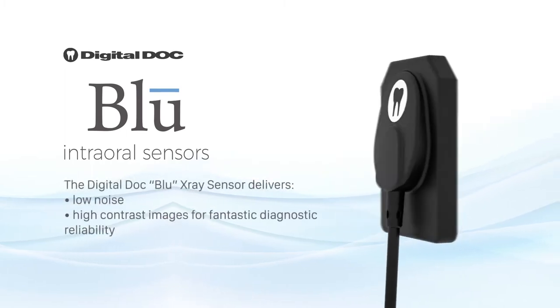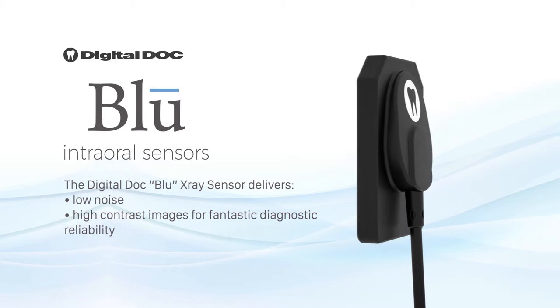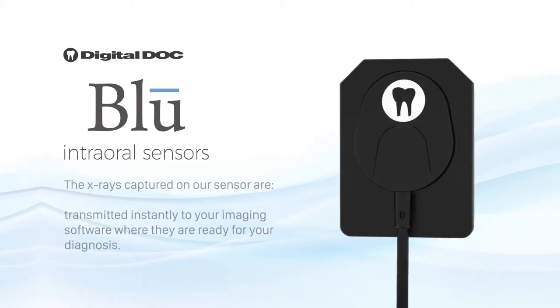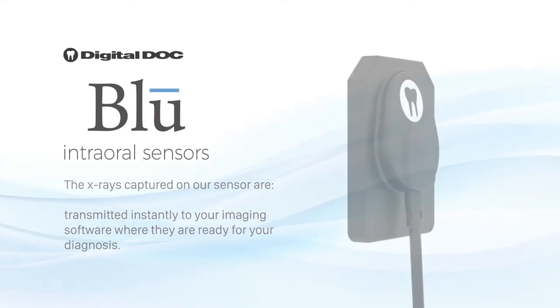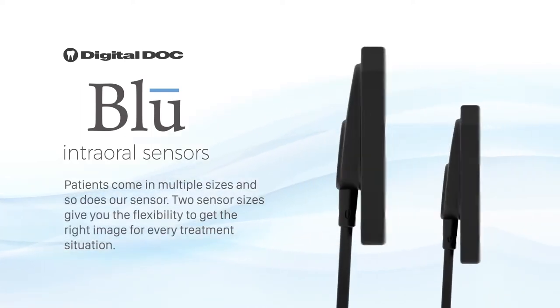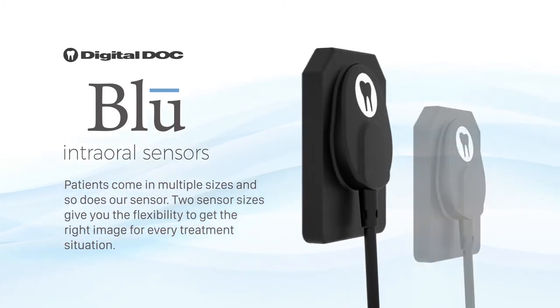The DigitalDoc Blue X-Ray Sensor delivers low noise, high contrast images for fantastic diagnostic reliability. The x-rays captured on your sensor are transmitted instantly to your imaging software, where they are ready for your diagnosis. Patients come in multiple sizes, and so does our sensor. Two sensor sizes give you the flexibility to get the right image for every treatment situation.